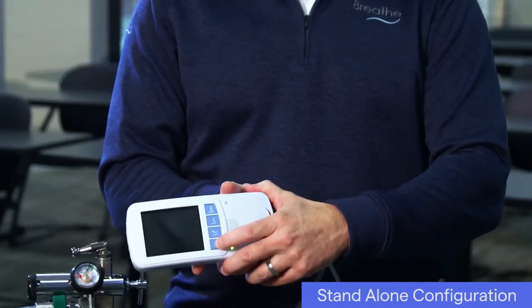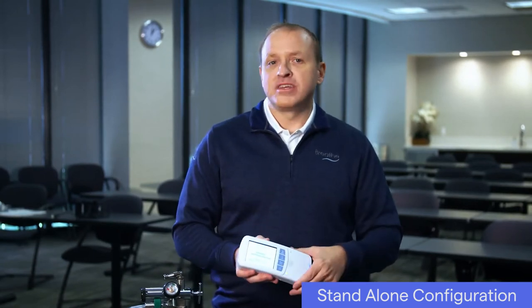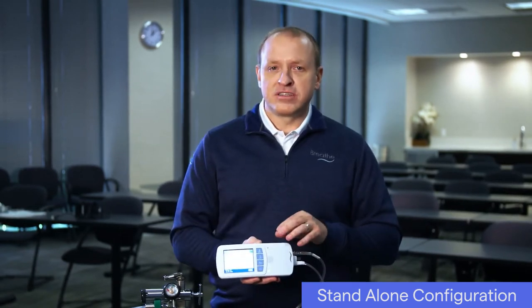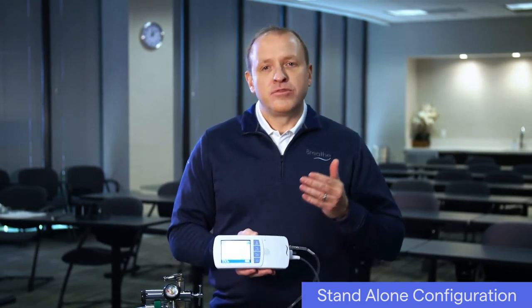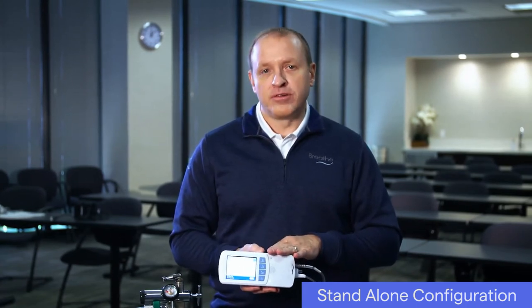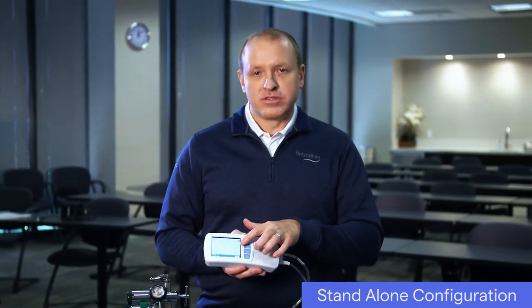Power on the ventilator by pressing the power button. The green power indicator light should turn on. The ventilator will perform a start-up sequence, which is displayed and accompanied by audible tones. All ventilator indicator lights should briefly flash and an audible alarm should briefly sound. If you do not hear tones when you turn on the ventilator, contact your healthcare provider. When the home screen is displayed, the ventilator is ready to use.